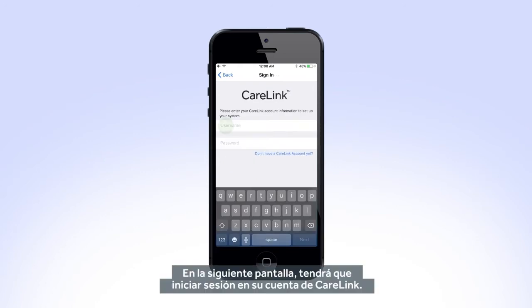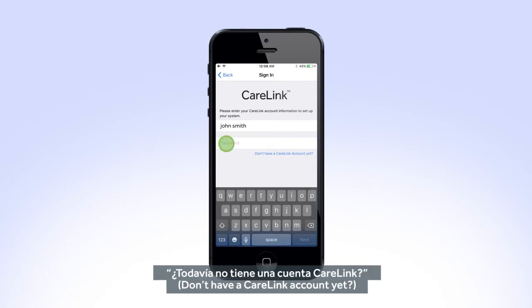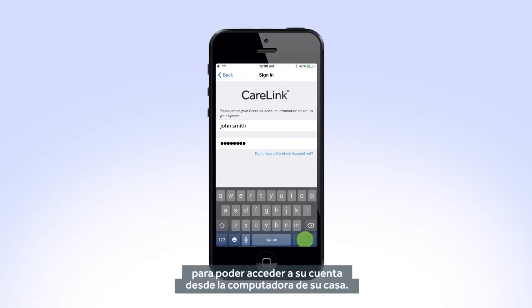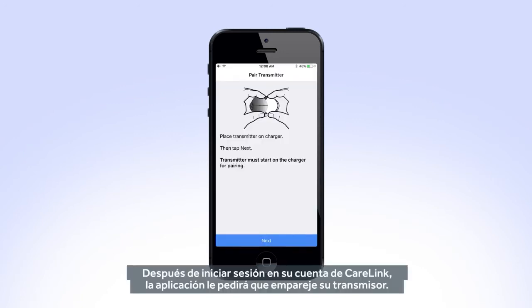On the next screen, you will need to log in to your CareLink account. If you do not have an account, tap on "Don't have a CareLink account yet" and follow the instructions on screen. You may want to write down your CareLink login information so that you can access your account on your home computer.